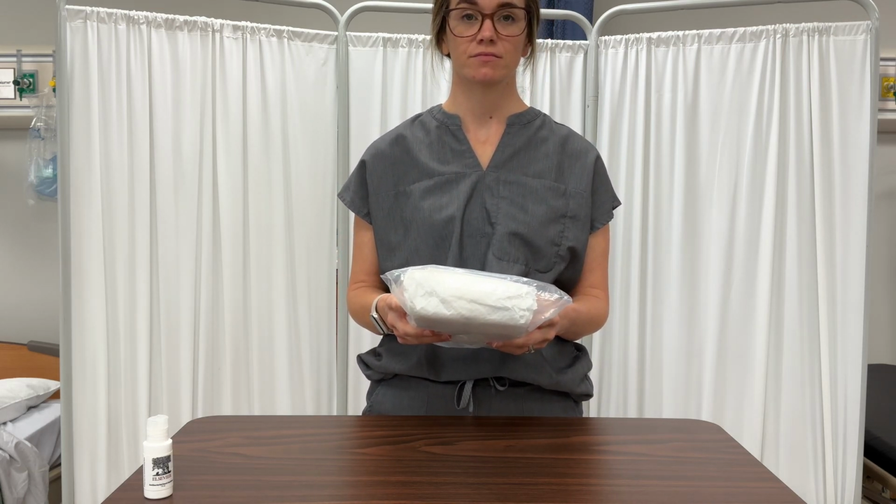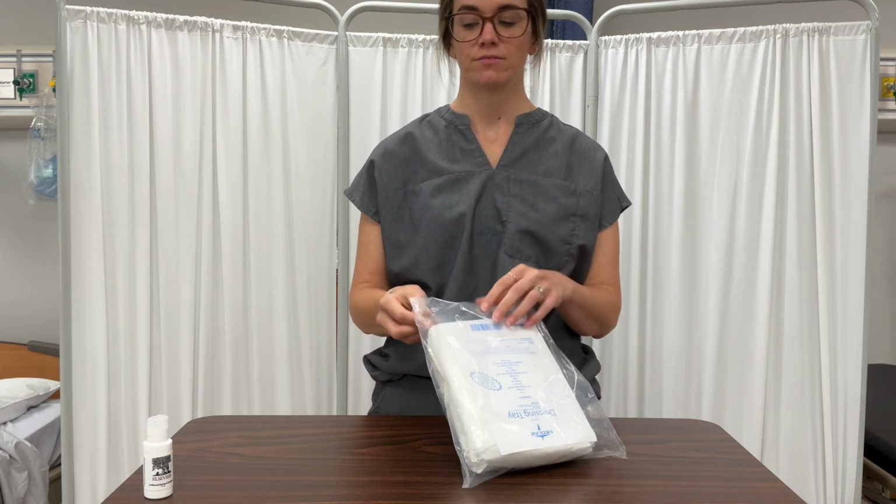The first thing that she's going to do after she's gathered her supplies is wash her hands.